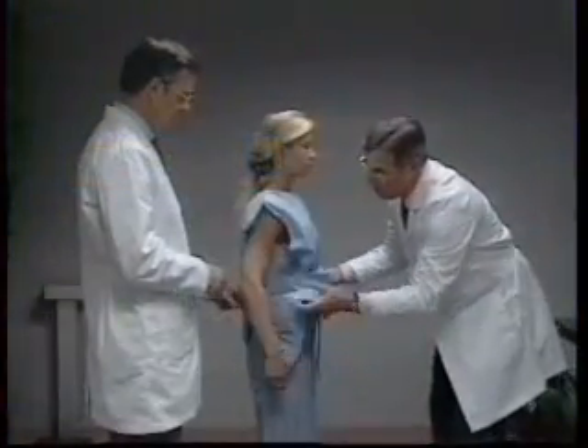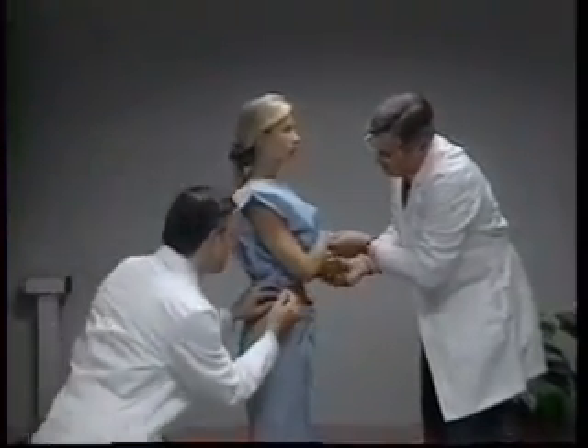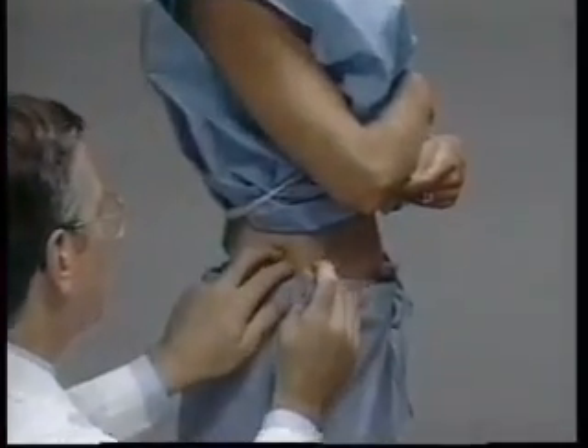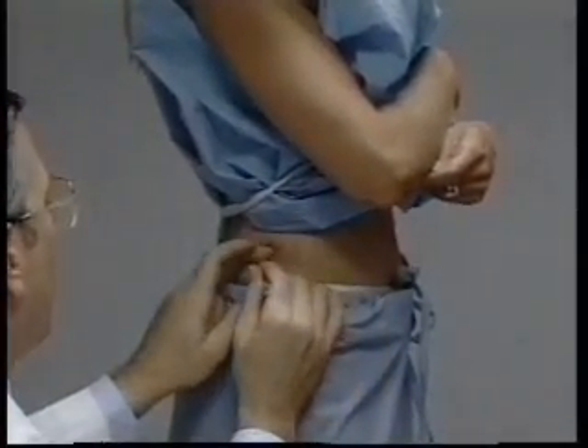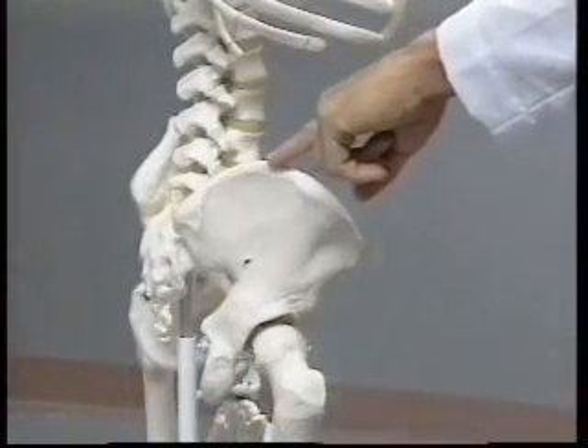To define the level at which the waist or abdominal circumference is measured, a bony landmark is first located and marked. The subject stands and the technician, positioned to the right of the subject, palpates the upper hip bone to locate the right ilium.